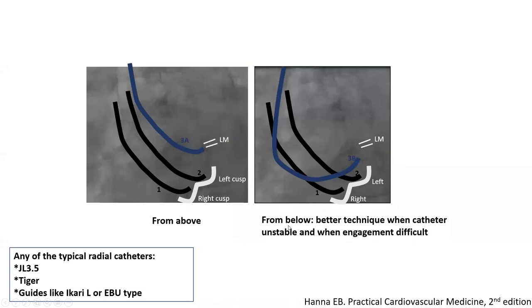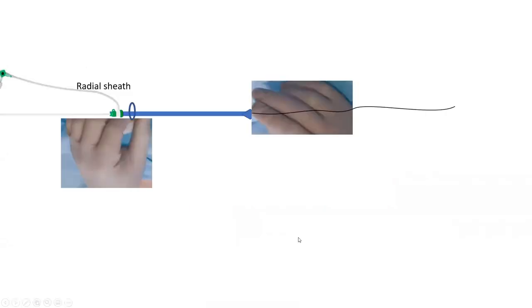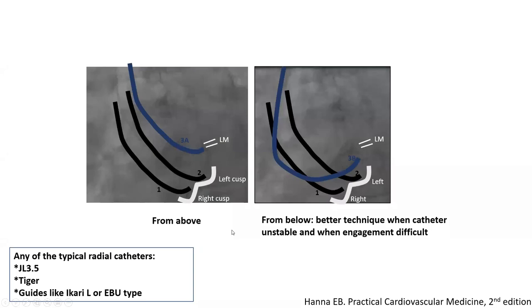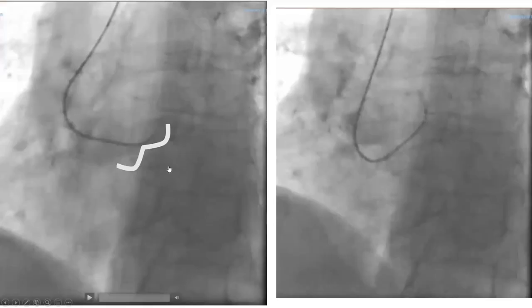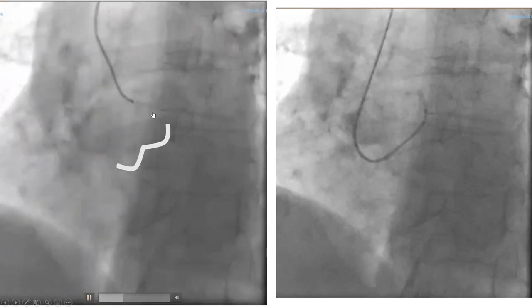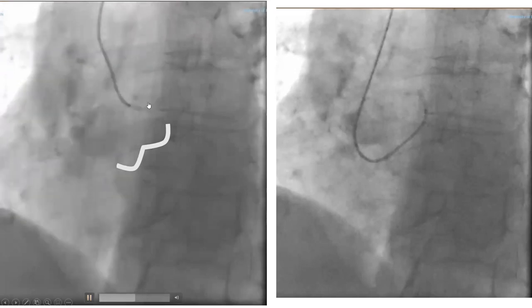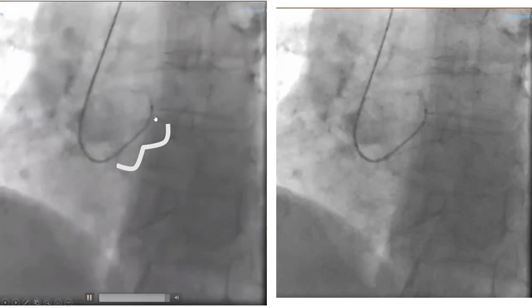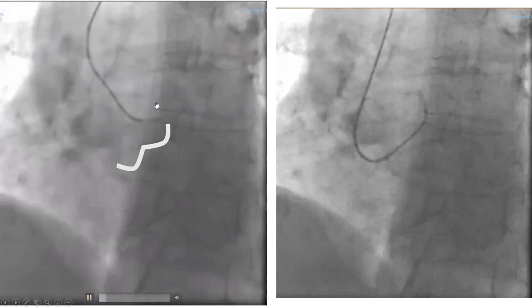The below engagement is definitely my preferred technique when the catheter is unstable and when engagement is difficult — such as a case where you have a bad innominate angle and you're worried the catheter will fly out and is unstable and poorly supported. You try to engage from below — that's the more stable engagement. Here is an illustration of left coronary engagement looped from below. We got to the left cusp, tried to engage from above with a certain torque — we tried to clock, it didn't work. So we pushed it back down and looped it from below.